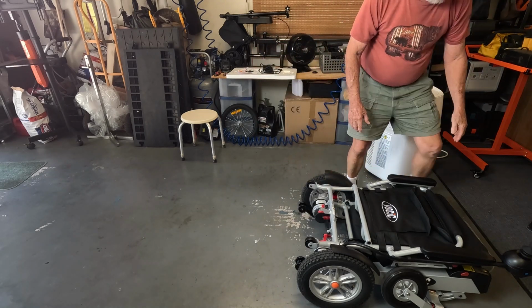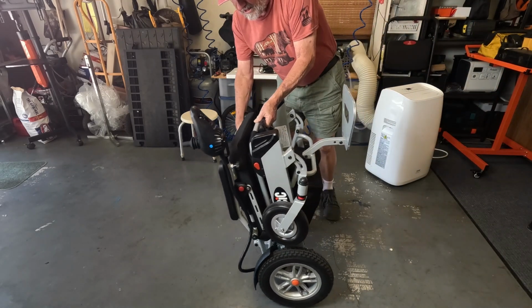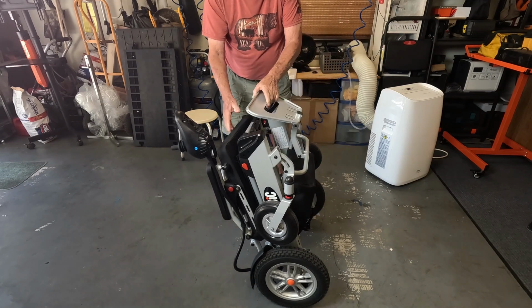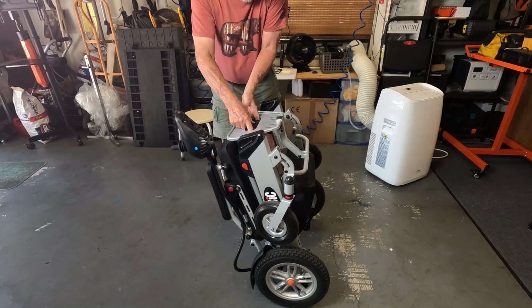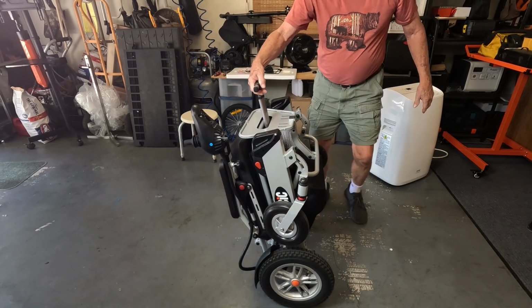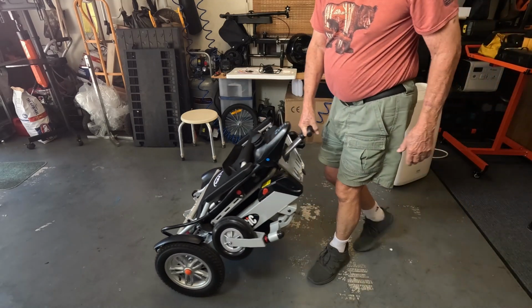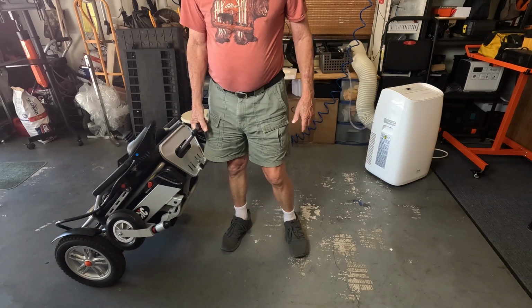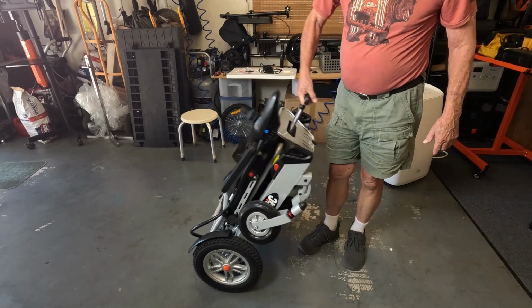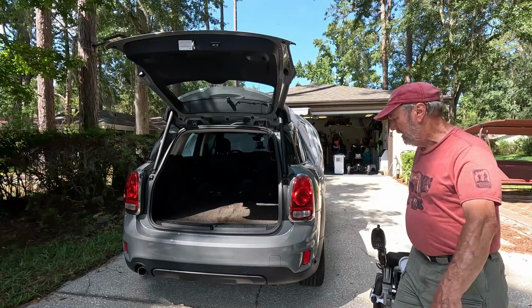Okay? And then you can pick this up like this, and you can just kind of tip it over like that. And here's something else, that if you want to tow this along, there's a handle right here that you can pull this over, and with it in the freewheel mode like that, you can drag it to the car. Now we're going to take this to the car and see if we can get this into the back of the car. Just roll her over, and it comes along nicely.